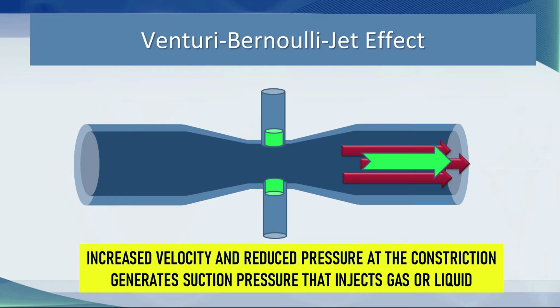The aperture narrows in the pharynx and trachea, and this sucks gas from the nasopharynx into the main airways and through the nostrils. So while wearing nasal cannulae, it's perfectly fine to breathe through the mouth, because gas flows into the mouth, and by the Venturi-Bernoulli effect, the gas in the nasopharyngeal reservoir is injected into that gas flow as it goes down into the trachea.